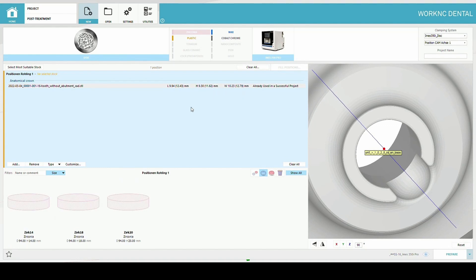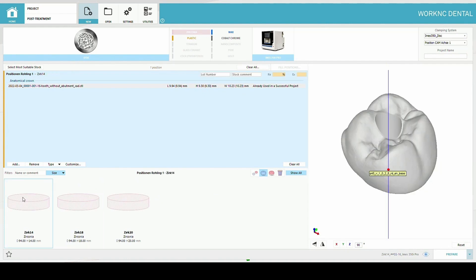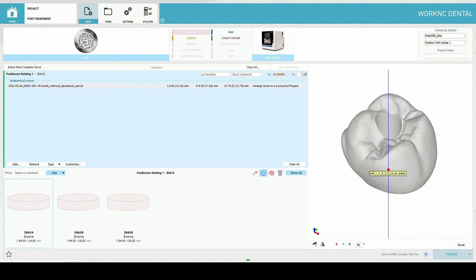Select the disk according to the size of the matrix crown. Fill in parameters and press prepare.